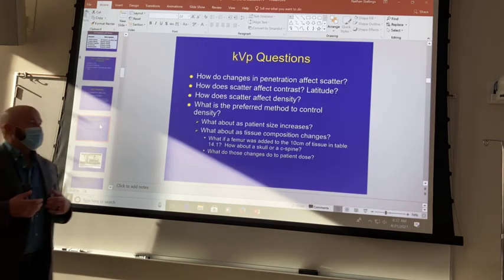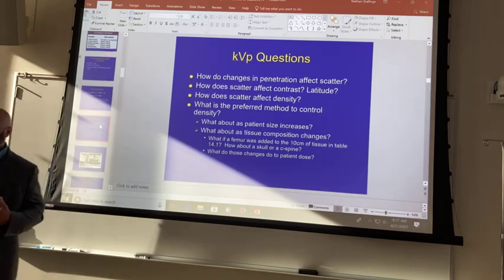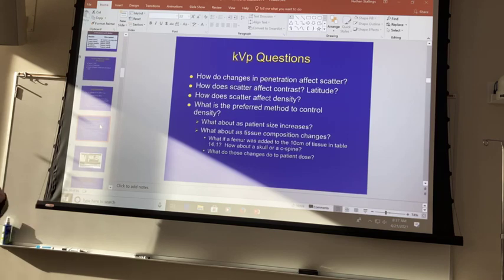So what do changes in technique do to patient dose? Well, as you increase either one, without an opposite change in the other, your patient dose is always going to go up. Do you have a question or are you stretching? Sure. Okay, all right. So everybody with me so far?